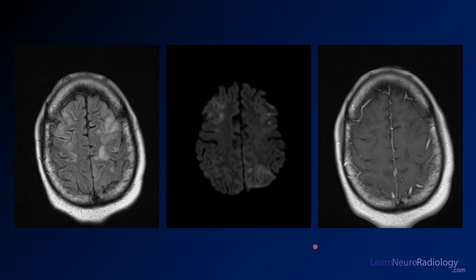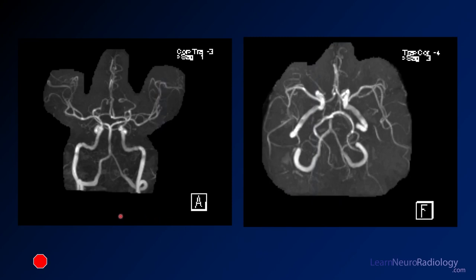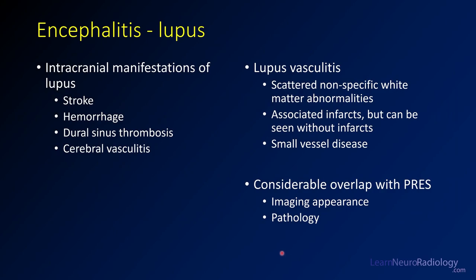More frontally, you see patchy dots of diffusion with not much enhancement at this level. The MRA shows both carotids look pretty good, and the vertebrals look pretty good — not a lot of vascular abnormalities. This is a case of encephalitis caused by lupus. These patients can get stroke, hemorrhages, dural sinus thrombosis, and cerebral vasculitis. Here there's a mixed picture with nonspecific white matter abnormalities and infarcts, particularly in the posterior fossa. This is small vessel disease, and you may not see much on an MRA — which was pretty normal here because the affected vessels are very small.